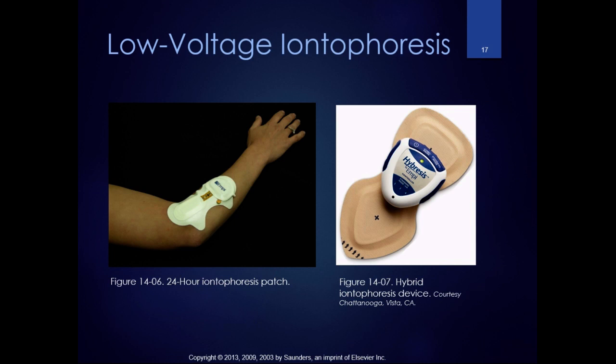In our clinic, we mostly use the 24-hour patch. We do use the portable units. Sometimes I've done it on people with altered sensation, and we use the portable unit because then we can monitor them the whole time instead of having them leave with it on, and had good success with that. So we'll practice it in the lab. It'll be fun.